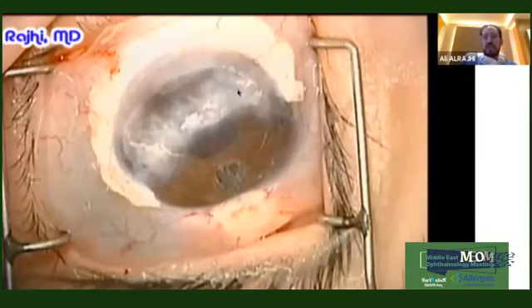Sometimes we have problems with this, not a lot. One of the cases that I presented in certain meetings developed epithelial ingrowth between the kerato patch and the thin cornea to the degree that one of the patients even had a fluid level.